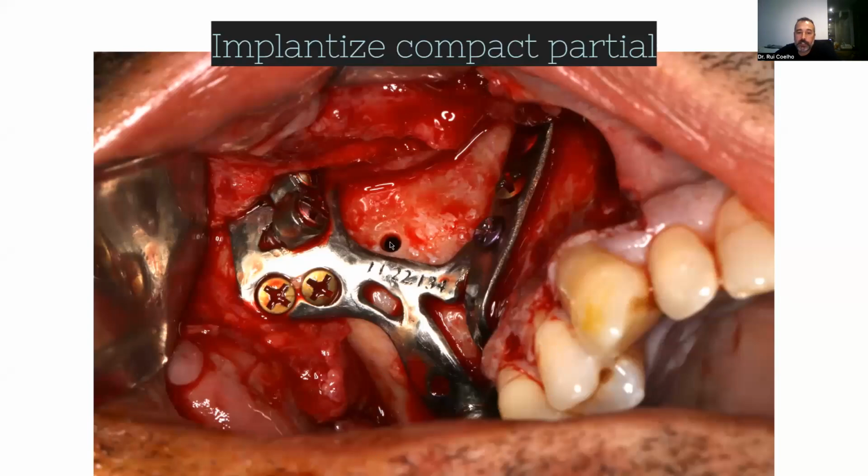So this hole was for fixing the guide. The screws that come here, also an ancient case. The screws, as you can see, have threads to the head, because it's very important that these screws stay here. And as you can see, it's less invasive than placing zygoma implants, because you don't need to see the upper part, because you don't have the risk. First, you don't have the risk to perforate the orbita. This is guided. Also, the direction is different.